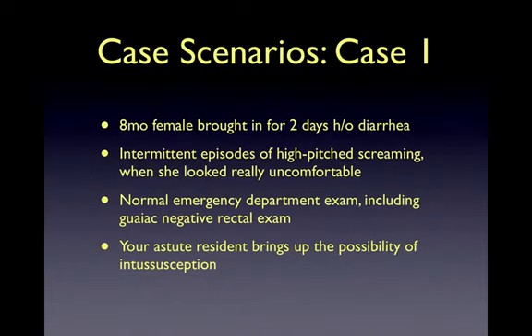So what are some of the good reasons to learn how to diagnose pediatric intussusception on bedside ultrasound? Let me illustrate this with a couple of case scenarios. First, you have an 8-month-old female who was brought in for 2 days history of diarrhea. During the interview, it was brought up that the child has had intermittent episodes of high-pitched screaming when she looked really uncomfortable. Her exam is all normal, including a guaiac-negative rectal exam.